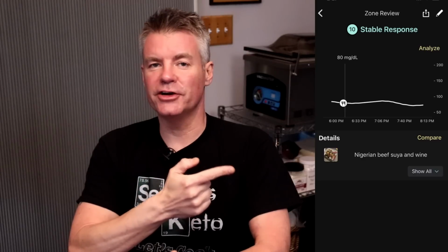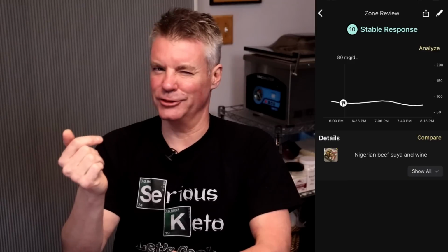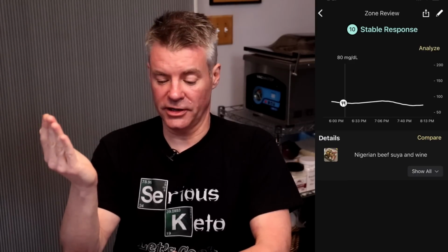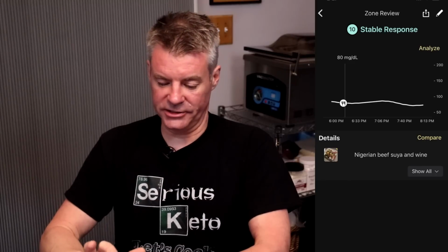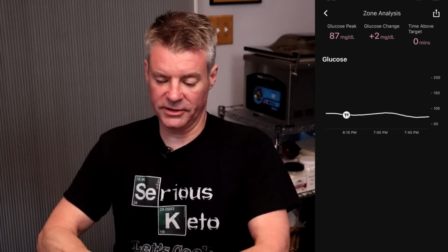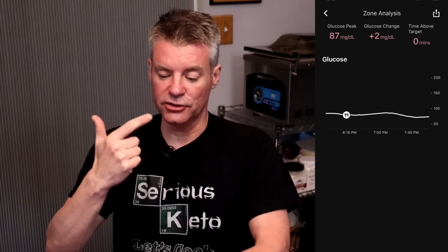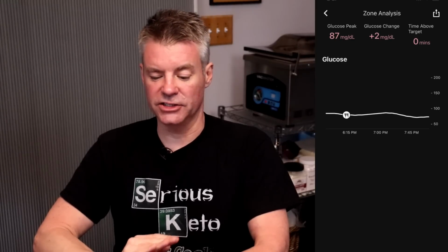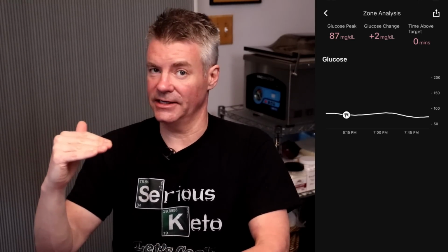So here is my Nigerian beef suya recipe, which I'll put as an end card to this video if you're interested in making that. I had that, and I had a couple of glasses of Cabernet Sauvignon, and you can see the response was a 10, so a stable response. If I hit Analyze, it goes into a little bit more depth. I can see that my glucose peaked at 87, so only a 2-point glucose change, and I spent 0 minutes above the target threshold, which is 110.